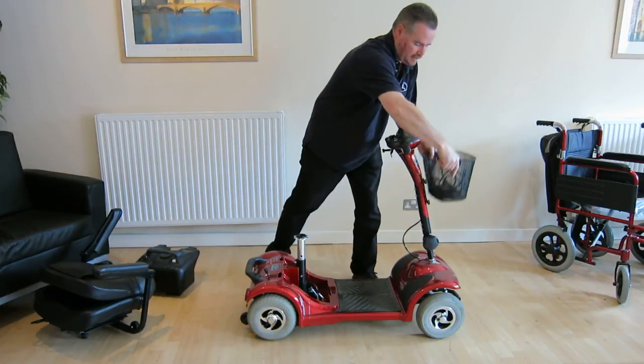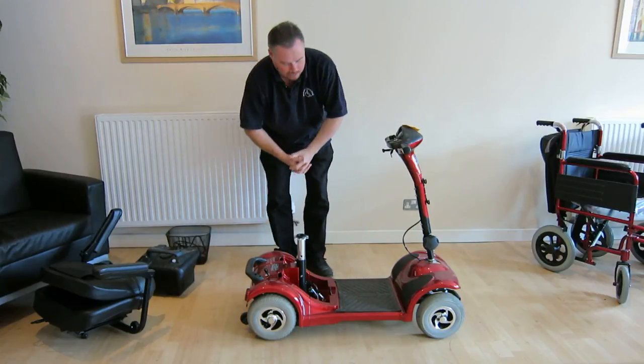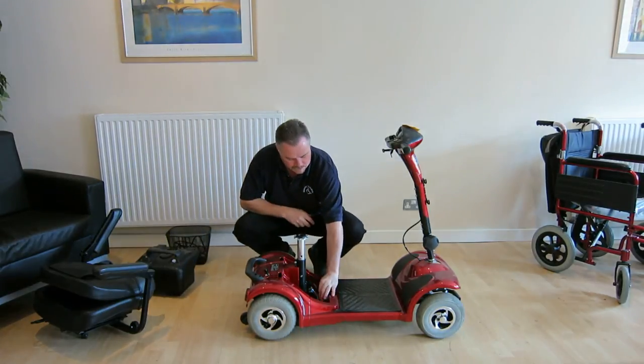The basket simply lifts off. To break the scooter apart, very simple, just undo the locking ring.